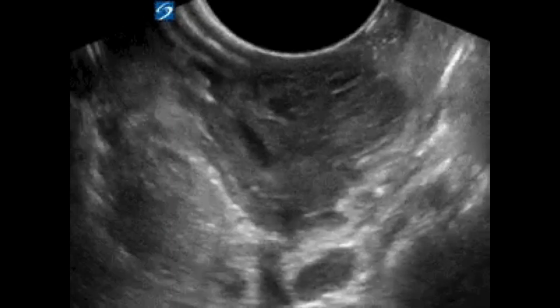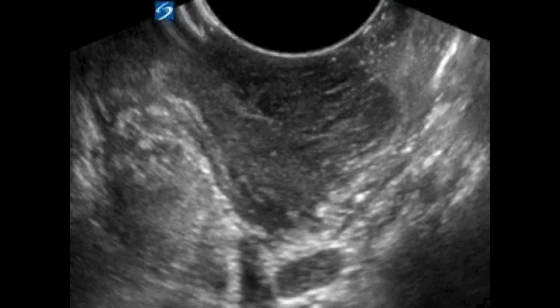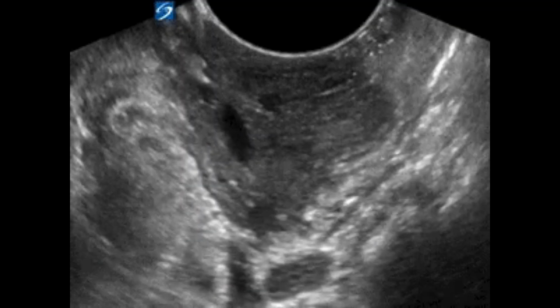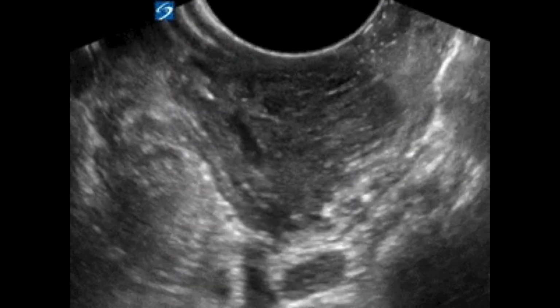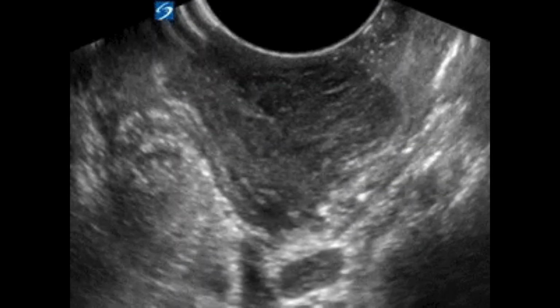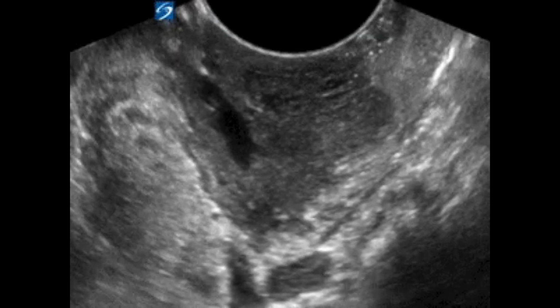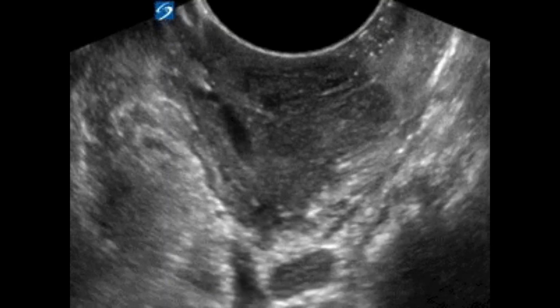Yes, sir, Dr. Payne. So if you're going for dynamic guidance, let's say you're right-handed and it's a right-sided abscess on the patient. Are you going to switch hands with your needle and your probe, or are you going to cross your hands? What's the best way to do that? I'd hold the probe with my non-dominant hand if I was trying to aspirate under direct guidance, would be my answer. Dr. Lewis, do you have any disagreement with that?